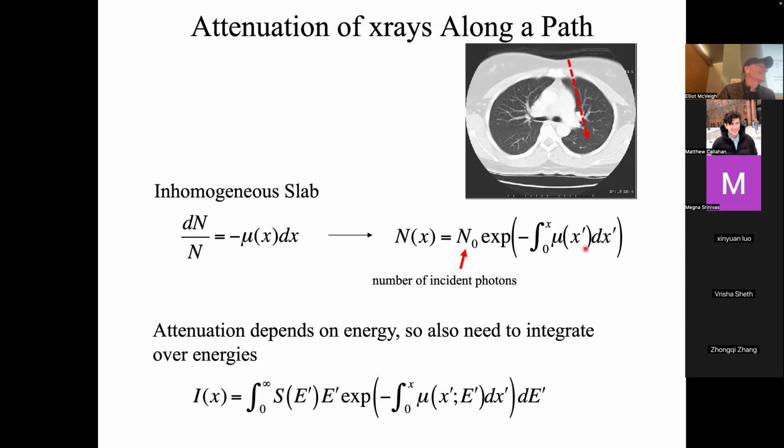That's the whole point, is that the image is going to be these values. This is really cool. This is where it gets cool. So now, if I have an image that has this value of every point inside the patient, well, that would be great, right? Because it tells me what that tissue is. Basically, it's a number that is different for different tissues. And so we're going to see how we get there.